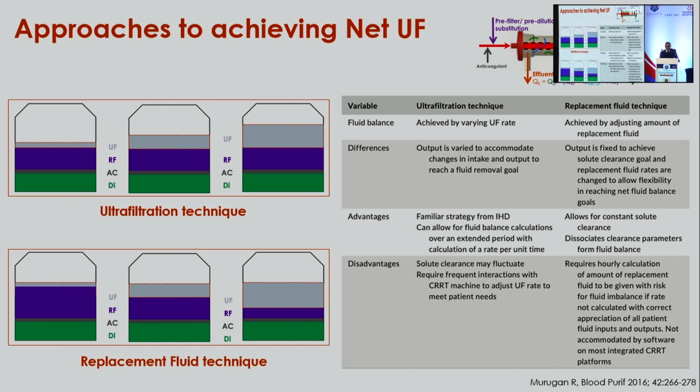But the flip side is that your effluent volume keeps changing per hour based on the UF rate that you have keyed in, which would essentially mean that the dose of dialysis delivered would be different, and the solute control and the solute balance may change with time.